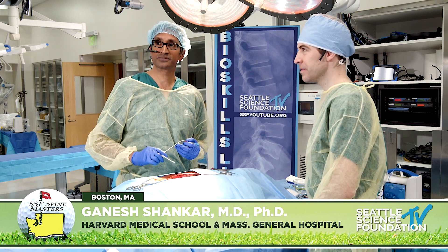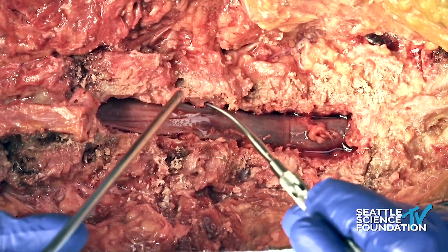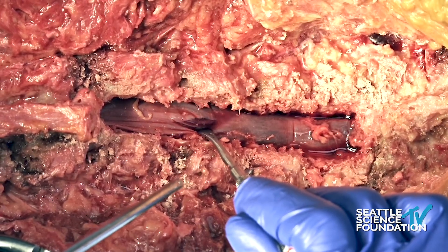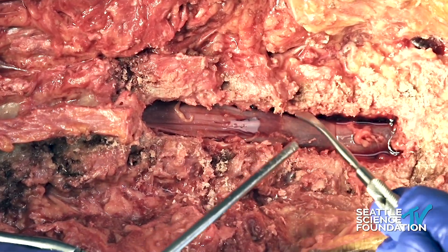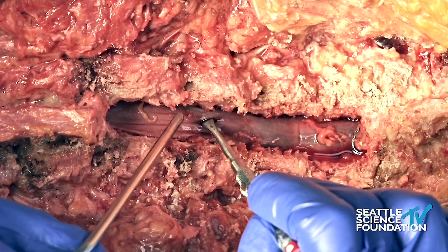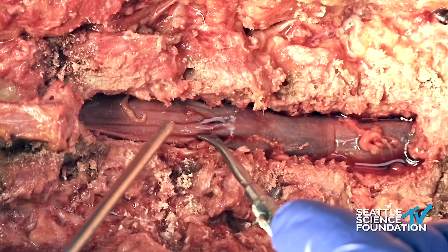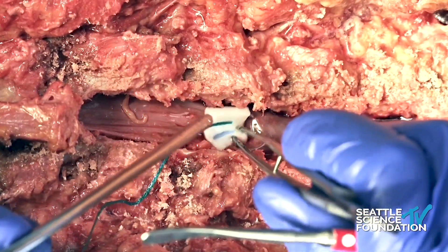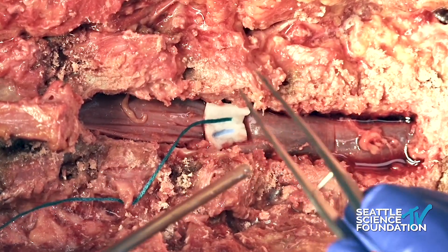Can the camera point down here? We have this very nice exposure and you can see here the completion of the decompression. We have a durotomy, and the first step when identifying a durotomy like this is to find someone else to blame even if you're fully responsible. Once you get that out of the way, it's very important to stay calm. As you can see in this durotomy, there are nerve roots of the cauda equina right under here, and to avoid having the suction drag up those nerve roots, I like to take a cottonoid and protect those nerve roots.